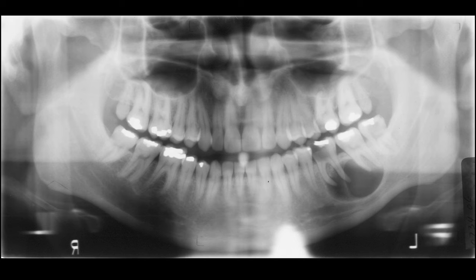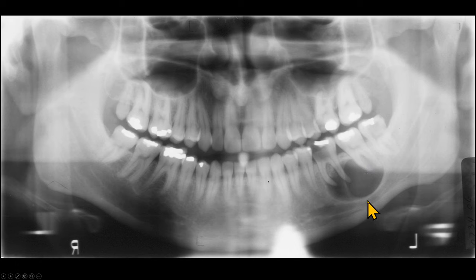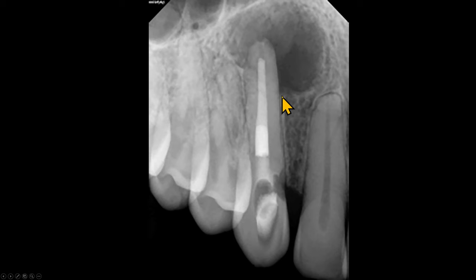On this panoramic radiograph we can see a well-defined oval radiolucent lesion with a corticated margin around the apex of the mandibular left first molar, which is carious. This lesion has displaced the root of the second molar as well as the inferior alveolar canal. On this periapical radiograph we see another example of a radicular cyst associated with a non-vital tooth; the apical few millimeters of the root canal are not obturated. This lesion is in contact with the floor of the nasal fossa, giving it an oval appearance.